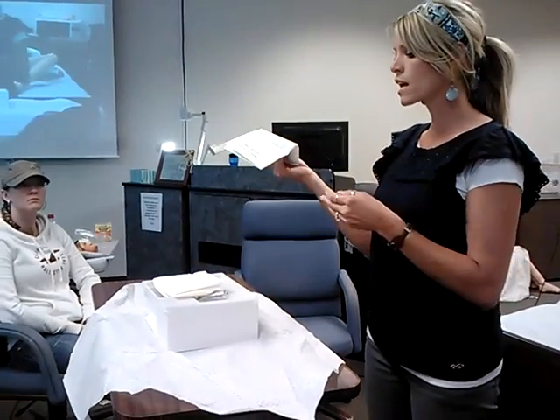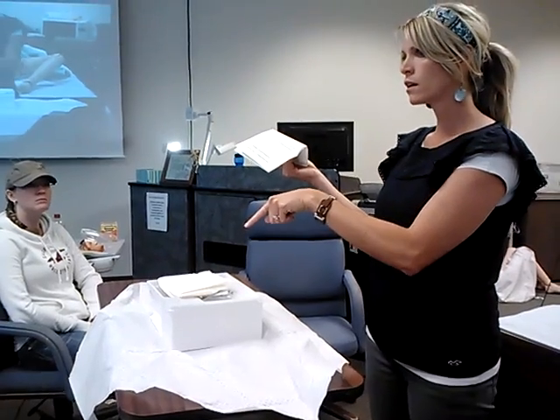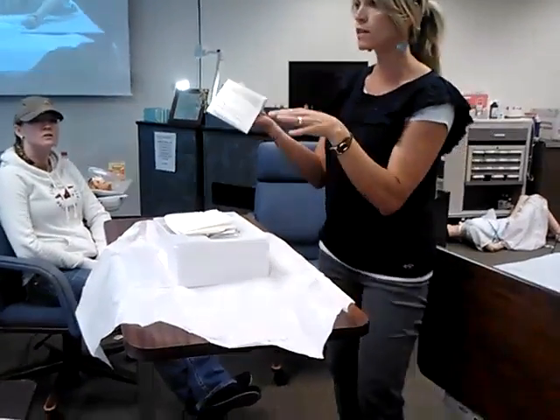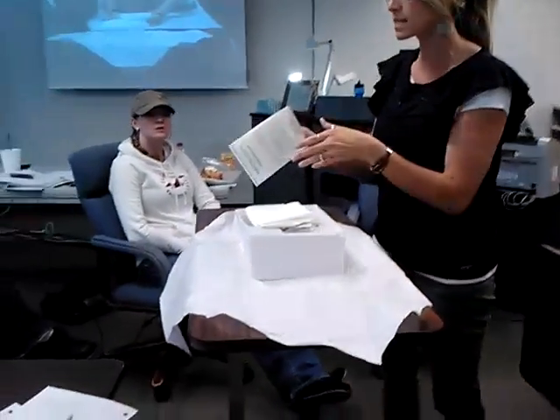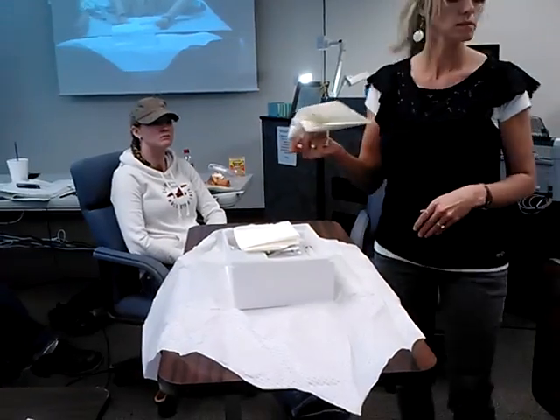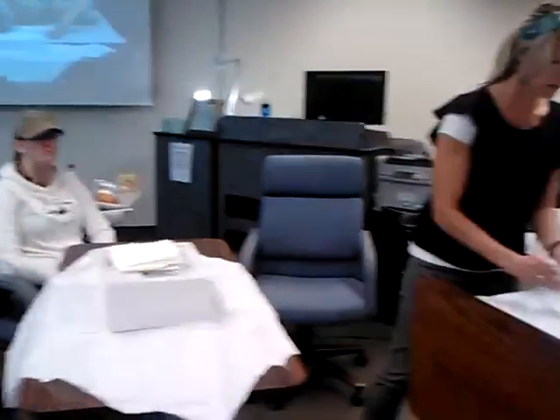And can you set your gloves on here? Yes. Be careful with touching it. If you're careful with touching it, you can. But for this purpose, because you guys can see me, I'm going to. If your hand's not sterile, you can't put it back. Okay. So I'll just set it here.